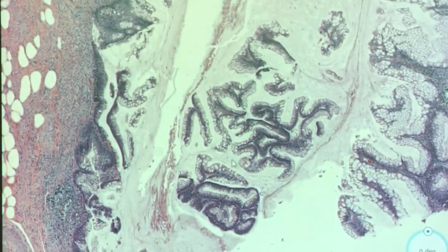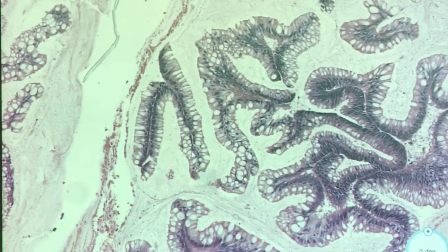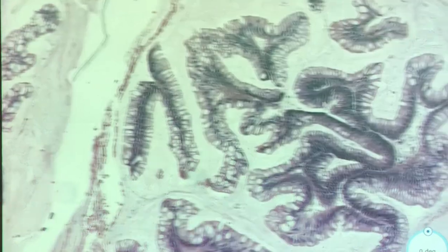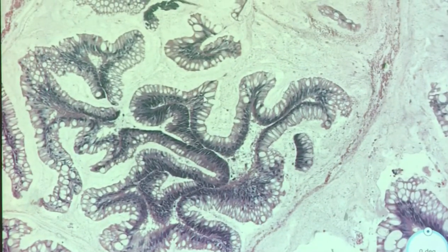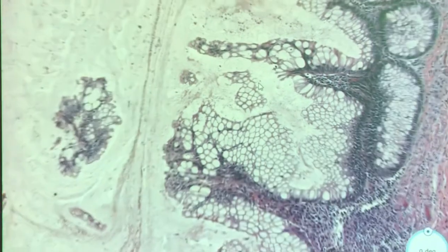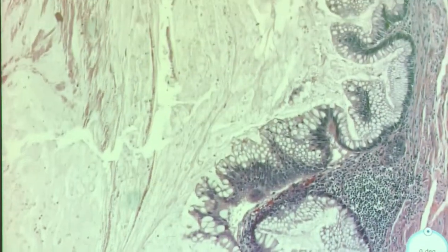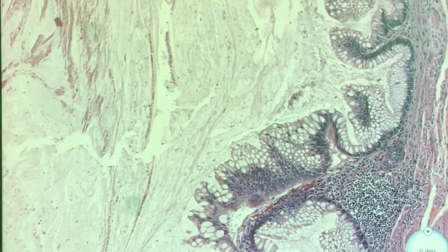And if we go in we see what type of epithelium right away. Columnar. Columnar, yes. And all these beautiful goblet cells. So this is what goblet cells look like normally. So hopefully, like, see, there's still some really round goblet cells in here. But this case is just really nice for showing that. There are areas within this section that are less mucinous. But then we start seeing stuff like this.